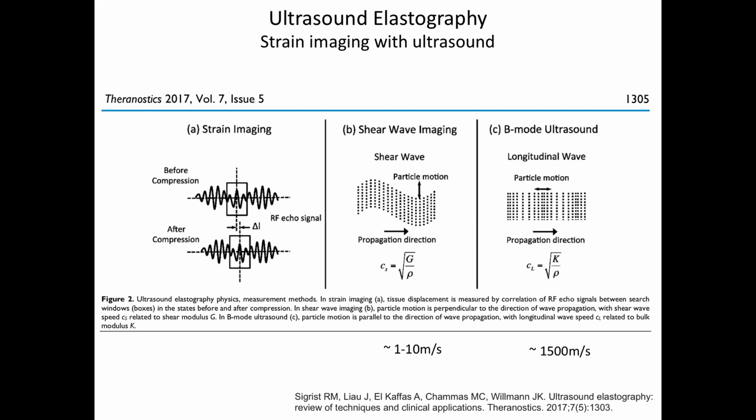And one of the things is the speed of the propagation of the shear wave or a longitudinal wave that is proportional, as we see, to that shear modulus. So you just measure the speed of the sound in there, and you get this contrast, right? Then you can have probes that themselves create shear waves by some kind of mechanical vibration. You can have an orthogonal probe that puts a ping into the tissue and you measure it while that ping is rolling by. Many, many different ways of skinning this cat.